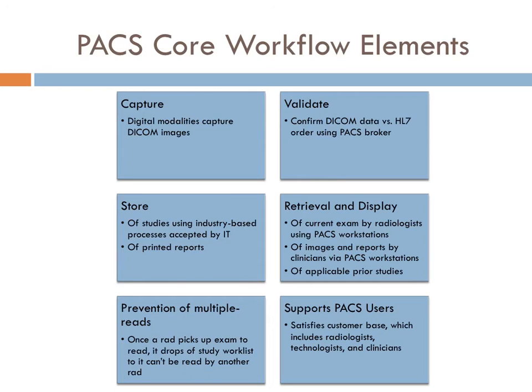PACS also supports PACS users. The PACS users could be the radiologists, technologists, the clinicians, and those are really the core customer base of PACS. And if these three groups are satisfied, then all is well with the world.